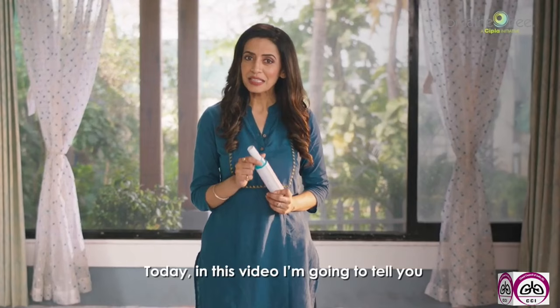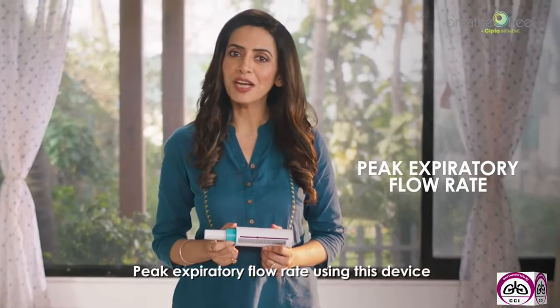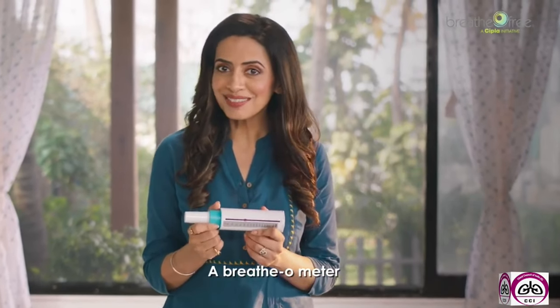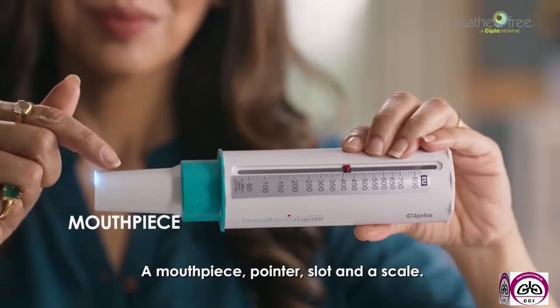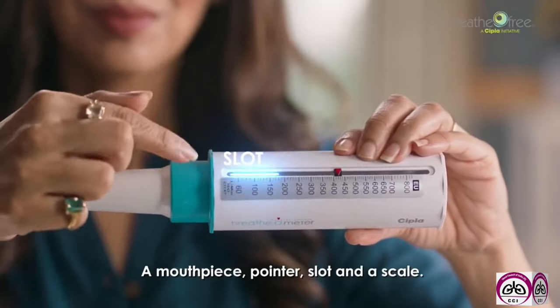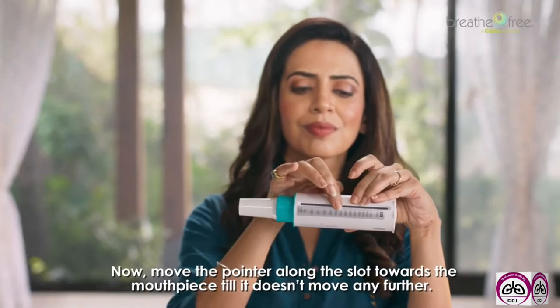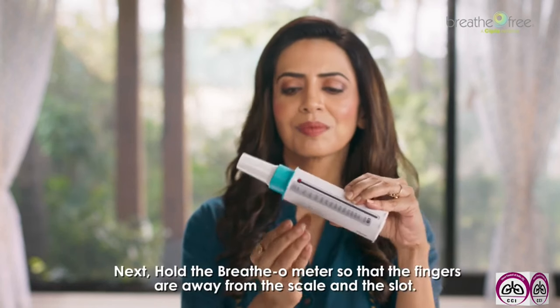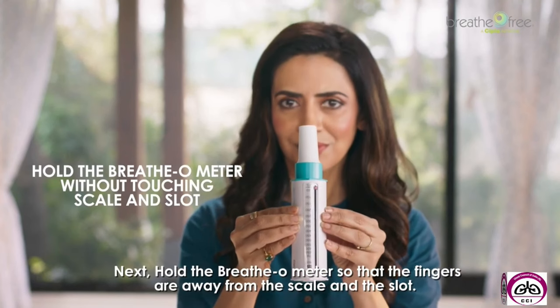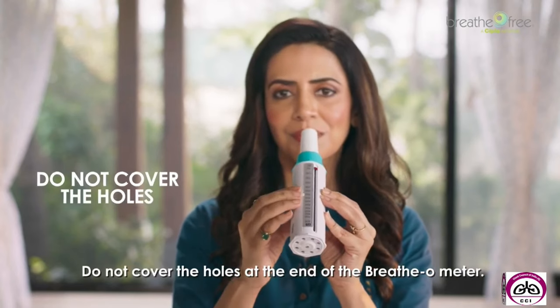Hello everyone. Today in this video, I'm going to tell you how to correctly measure your lung function, that is PEFR, peak expiratory flow rate, using this device, a breathometer. Let's get started. A breathometer has the following parts: a mouthpiece, pointer, slot, and a scale. First, join the mouthpiece to the breathometer. Now, move the pointer along the slots towards the mouthpiece till it doesn't move any further. Next, hold the breathometer so that the fingers are away from the scale and the slot. Do not cover the holes at the end of the breathometer.